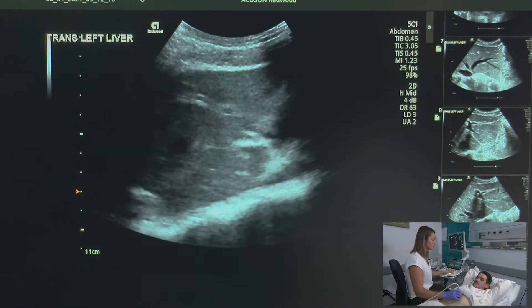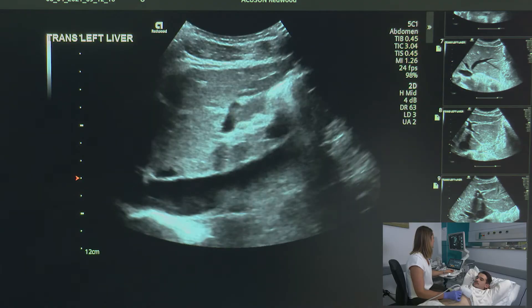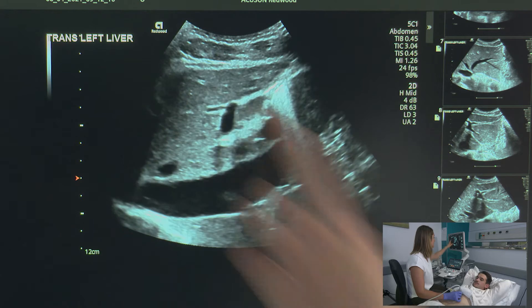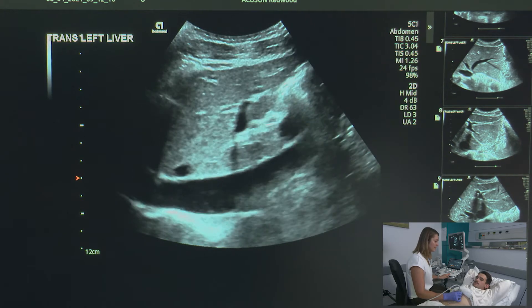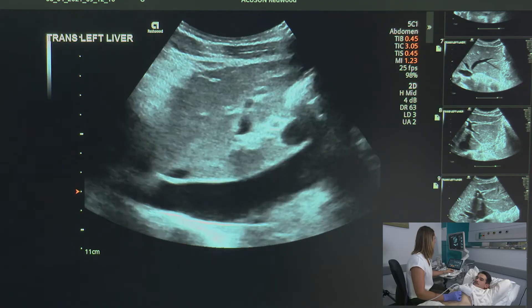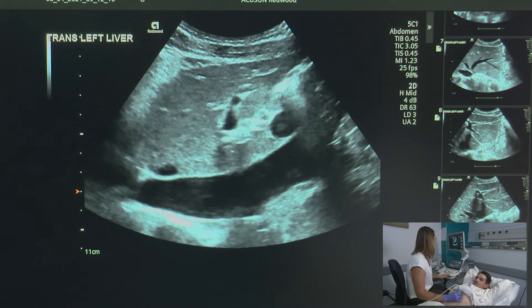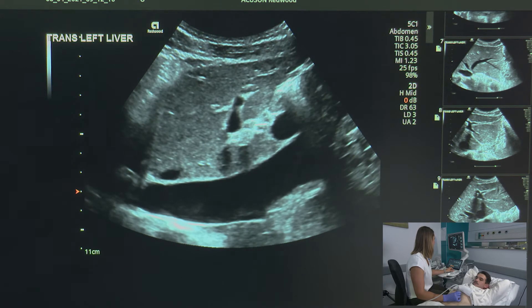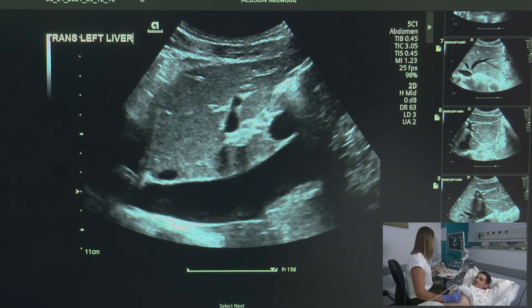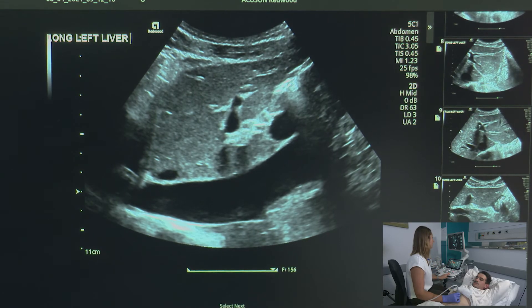Now I'm going to do my longitudinal images. The first one I'm going to take is of the IVC, including the diaphragm. Big breath in — hold it. I'm going to adjust my depth, making sure that my focus is at the posterior aspect of my liver. Breathe. I'm going to annotate so that it says: long, left, liver.